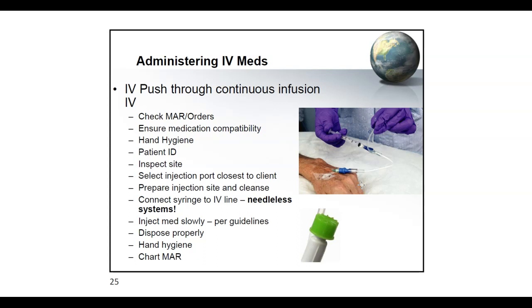Obviously, needles go to the sharps, and then everything else, depending on your policy, some may go to the trash, and then if there's some drugs, then it may need to go to the blue bin. Anyway, dispose them accordingly, and then hand hygiene, wash your hands, and then chart in the MAR. And make sure you go back to evaluate the patient for effectiveness, and of course also any possible adverse reactions.